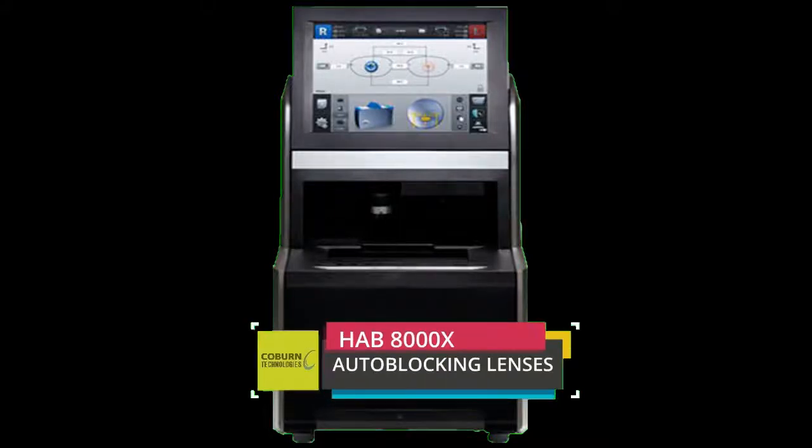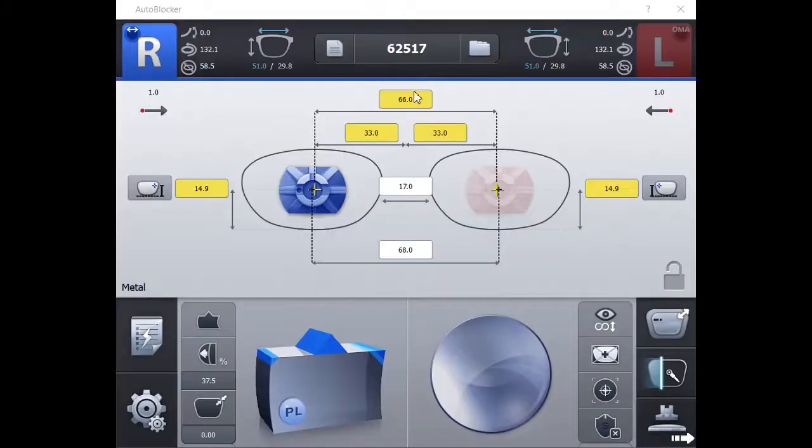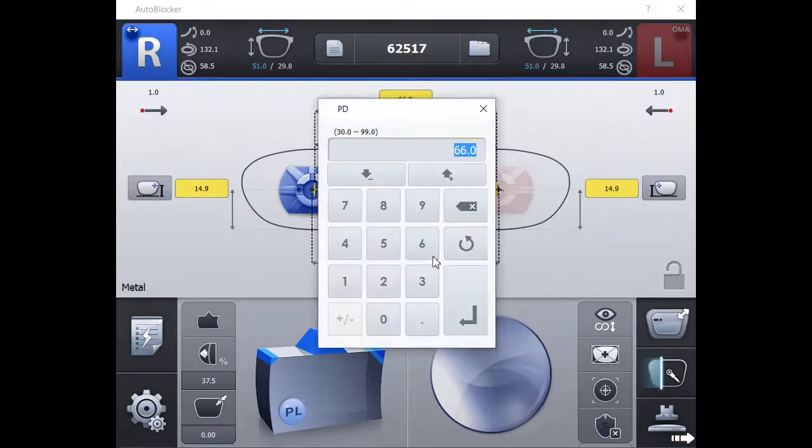HAB8000X auto-blocking. Prior to blocking, enter all specific information associated with this job.